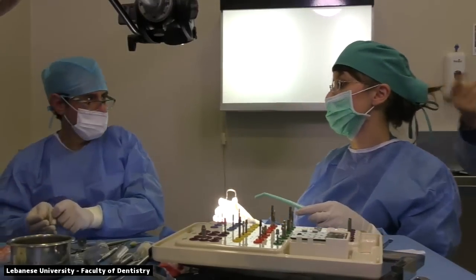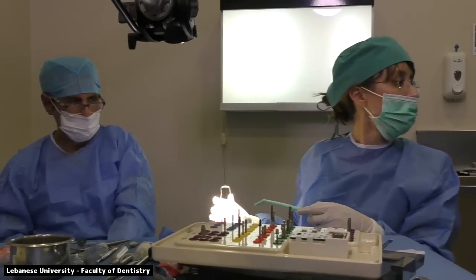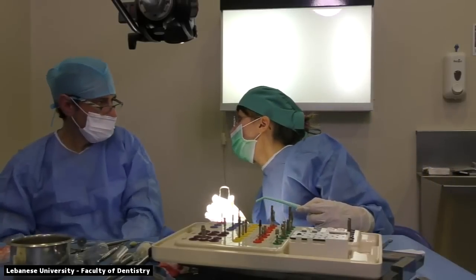So now we're going to add the Bio-Oss, the bone graft material. This is a xenograft material that would be added.